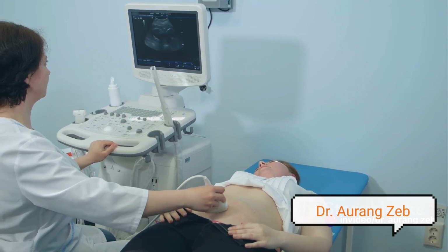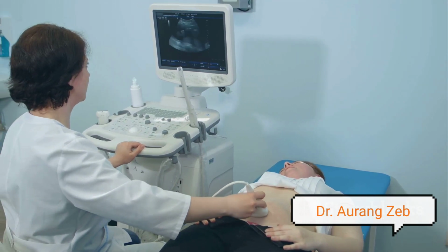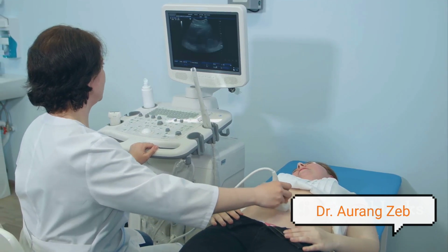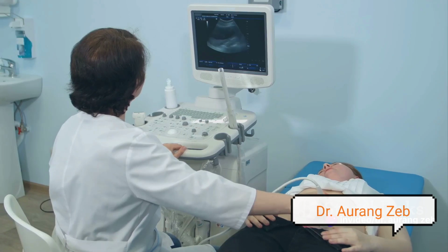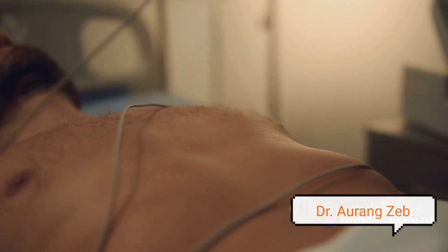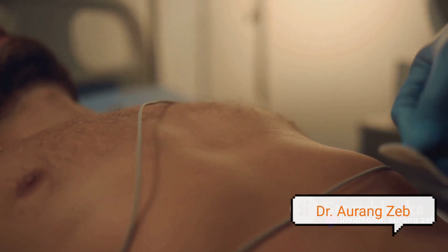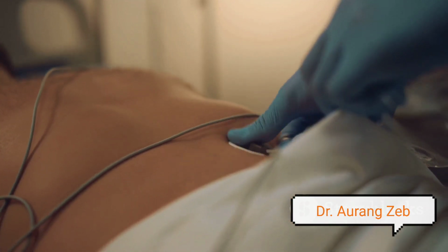Then, we discussed patient positioning and probe placement, both of which play a significant role in obtaining clear and detailed images. We also explored echocardiographic views and parameters, which are the building blocks of a comprehensive echocardiogram. By understanding these different views and what they represent, we can better interpret the data and make accurate diagnoses.